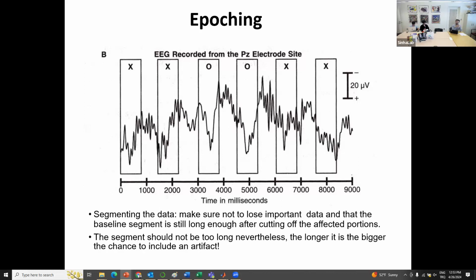That's why we have, for example, brain signal bands like alpha band, beta band, different bands corresponding to different frequency components in the signal. And they are very useful for identification of neurophysiological phenomena or the cognitive processes that the brain is running. For example, when you sleep, it changes the EEG frequency spectrum dramatically.